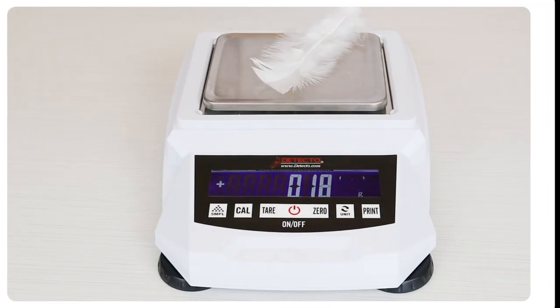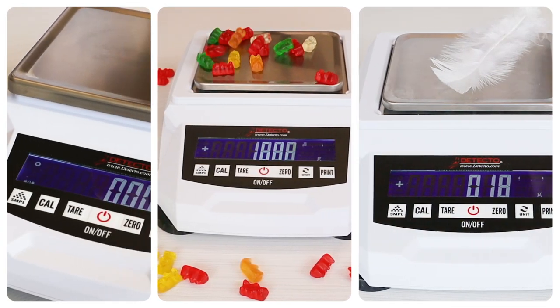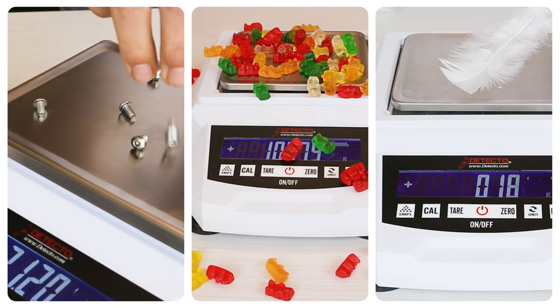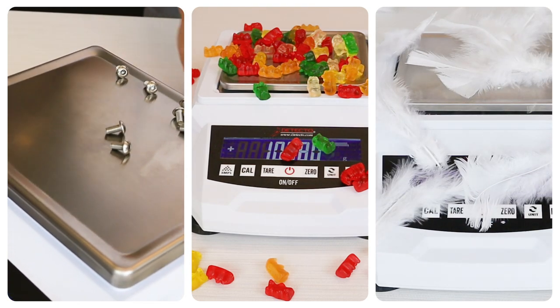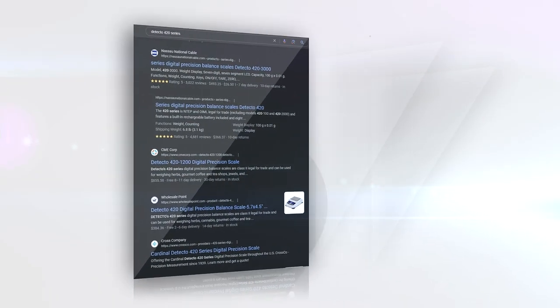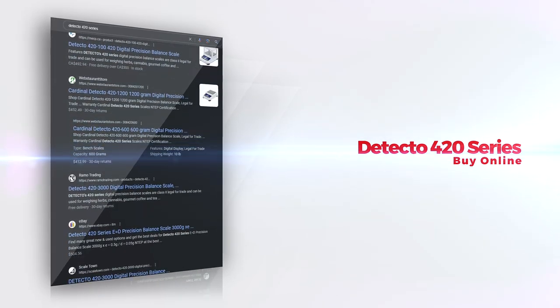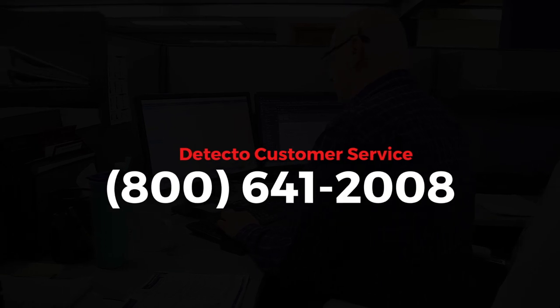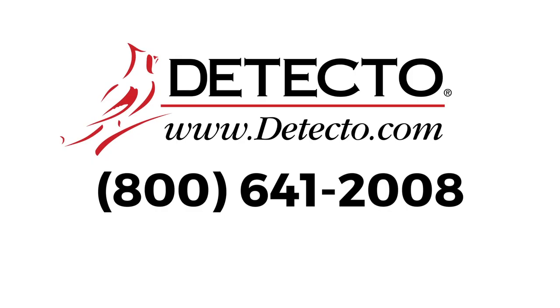From weighing the lightest of feathers, to CBD gummies, to small nuts and bolts — when pinpoint precision is paramount, Detecto's 420 series delivers without fail. The 420 series can be purchased from many of Detecto's authorized e-commerce distributors online by searching for Detecto 420 series. For information from the factory, please contact us at 800-641-2008 or visit Detecto.com.